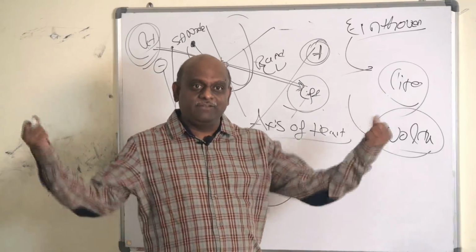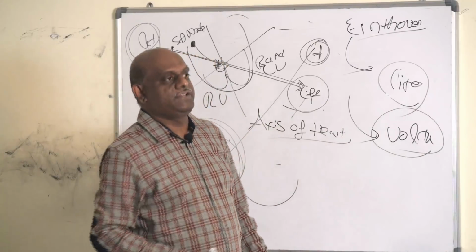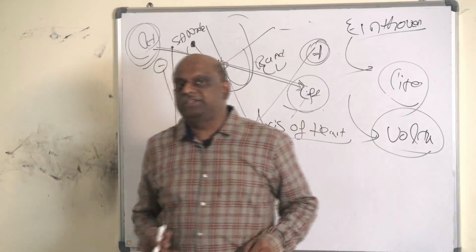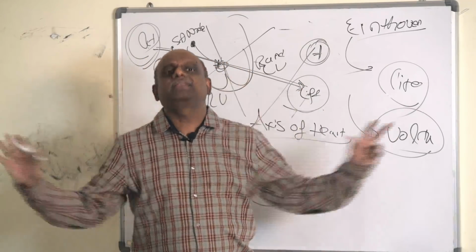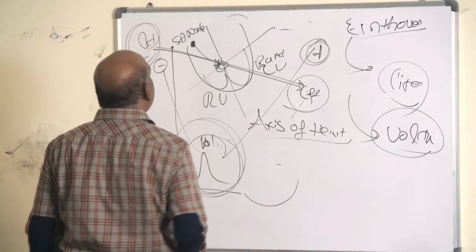Otherwise your father-in-law will become electrocuted. So the right leg is useless for ECG. It is only for earthing. What are the three limbs which are important for the ECG, doc? Right arm, left arm, left leg. Only these three things are important for the ECG is what you need to remember.